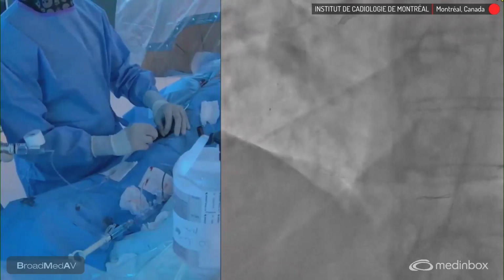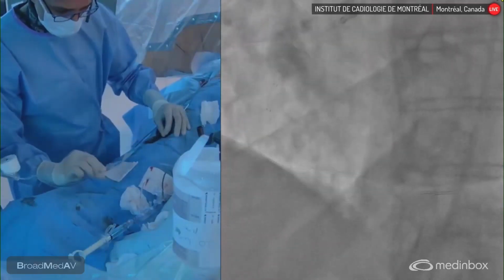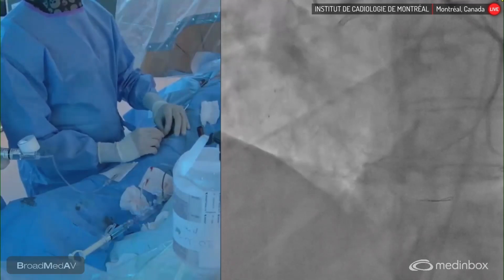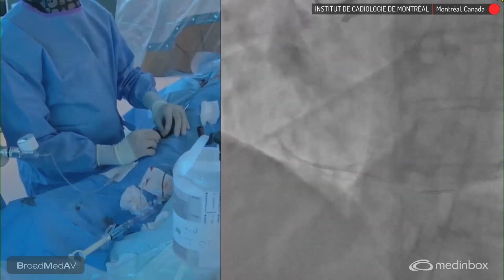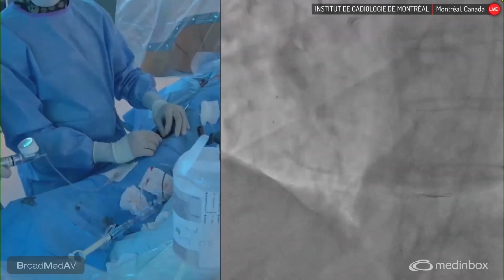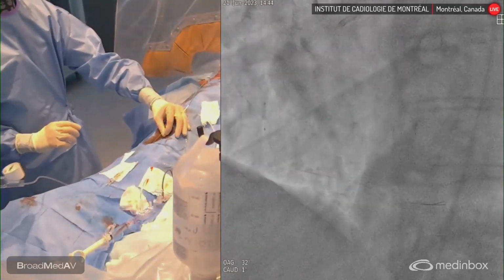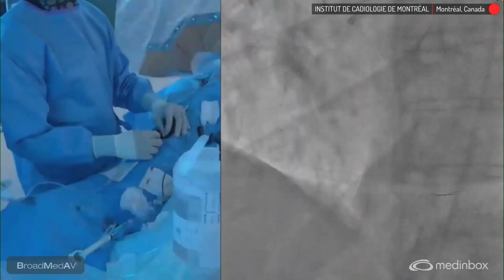So far, so good. So this is a 2.5 by 12. So we'll be gentle. Let's go. Okay, so we test first to see if it's in the right place. Yeah. I have resistance here. Okay, I think we can start here. Yes, okay, so we go carefully. 6. Can you save this, please? Perfect.